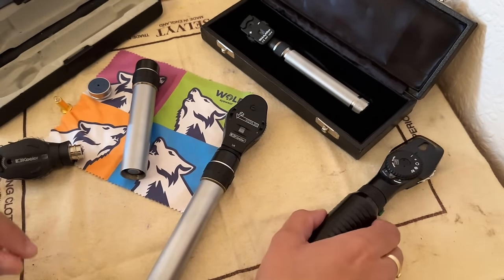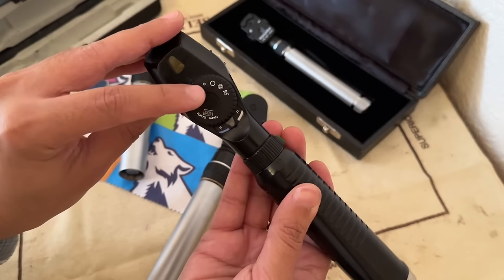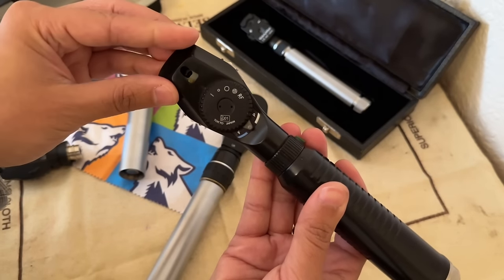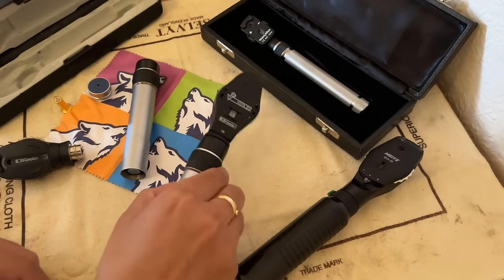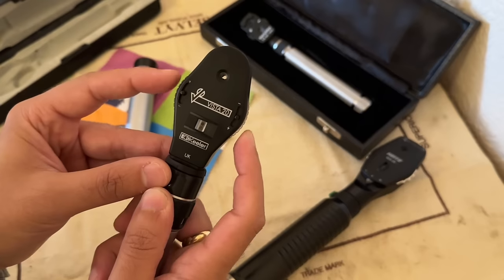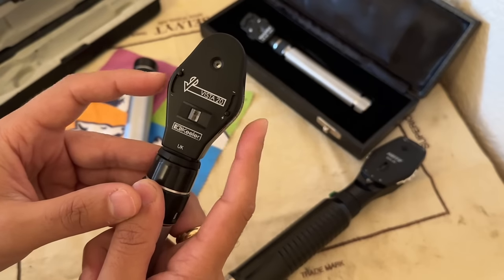Taking this Neitz model here, you can see the apertures that come with this one. You have a red-free, which is your green light, the target, large aperture, small round aperture, and a slit. You have your protective window and your focusing wheel for optimal image quality. If you need to go out of the standard range, you can sometimes flick the switch and go even further with your lens powers.